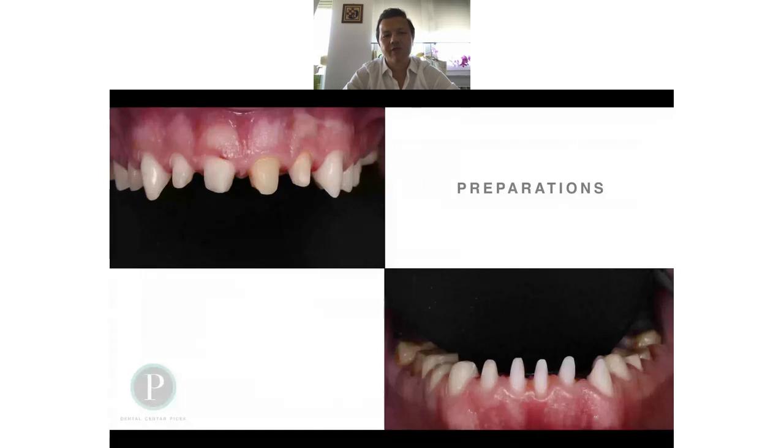But what's important for this situation is, I hope you remember the initial photos, you will see it later on, there were many old direct restorations which were not, for me, well polished. After that, we need to replace them. If you choose this kind of therapy, it is, how to say, reversible, because after, I think, 5, 6, 7 years, we will do the same procedure again.